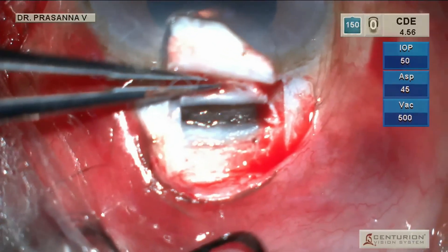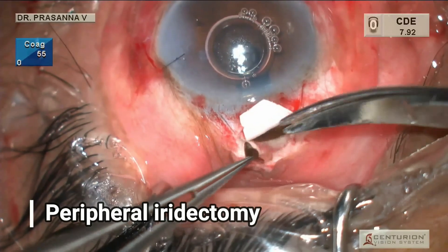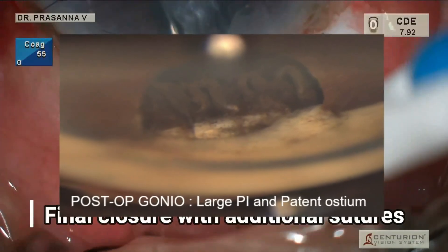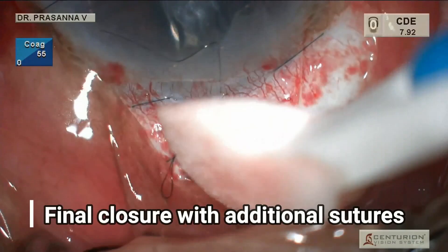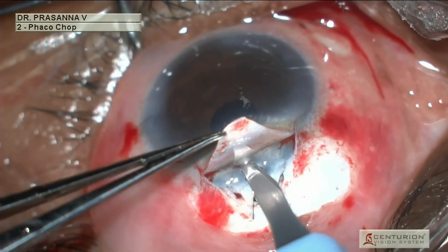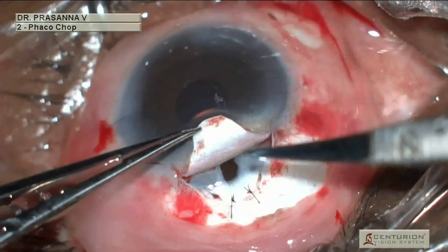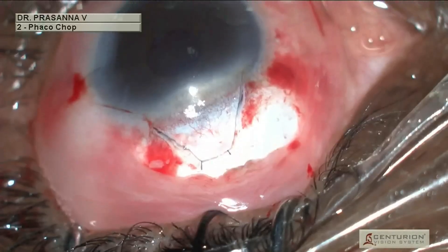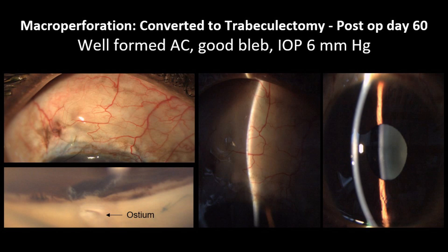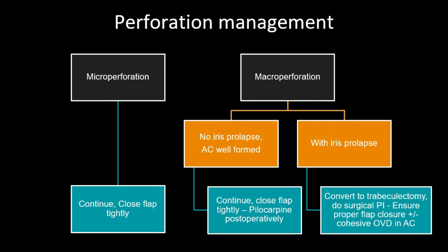Here we see a macro-perforation with iris prolapse. Once this happens, NPDS has to be converted to trabeculectomy and a surgical PI should be done. An alternative strategy is to close the deep flap, make a new ostium, and proceed with trabeculectomy normally. Ensure no leak at the end of surgery. This slide summarizes the micro- and macro-perforation management strategies.